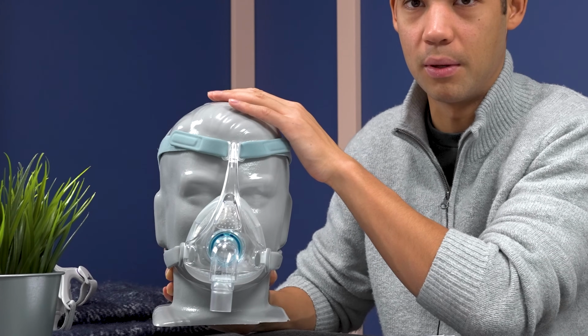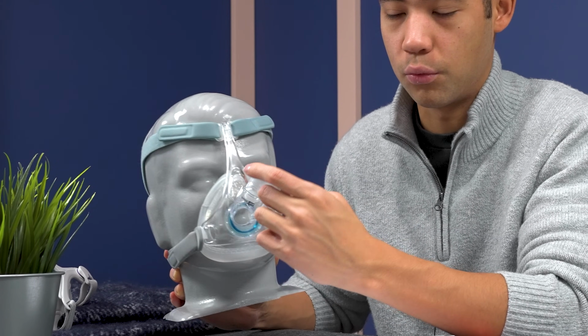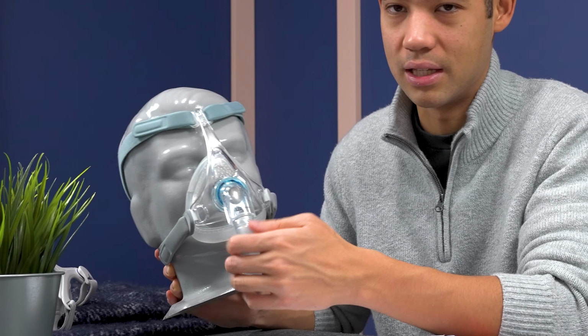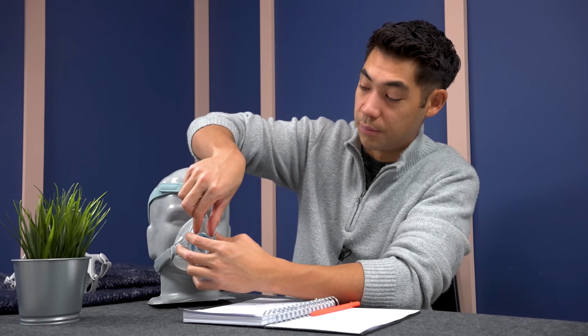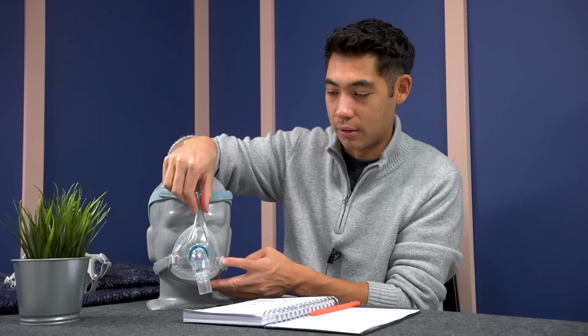Now I already talked about the benefits of a top mounted mask. So that is, I guess, a con of this mask, but you do get like a 360 ball joint with this. So it's as good as it's going to get. And of course you have the stability bar going all the way up. Now I know with masks with kind of a stability bar like this, it looks a little intimidating because it just looks really heavy from the front.